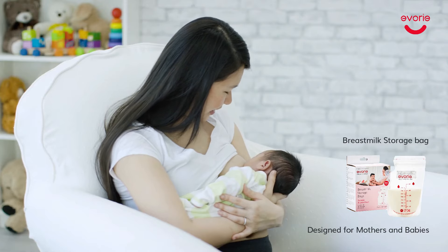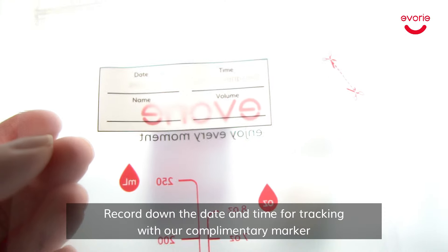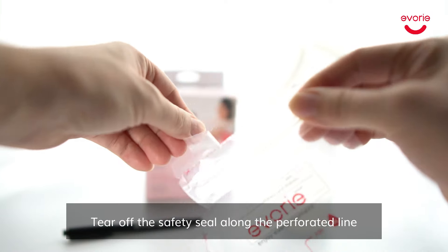Avori Breast Milk Storage Bags, designed for mothers and babies. Record down the date and time for tracking with our complimentary marker. Tear off the safety seal along the perforated line.